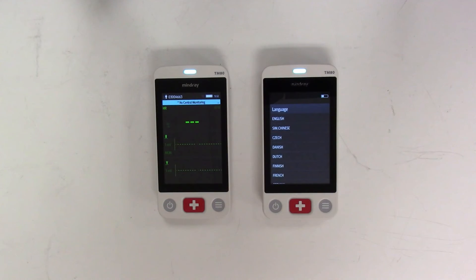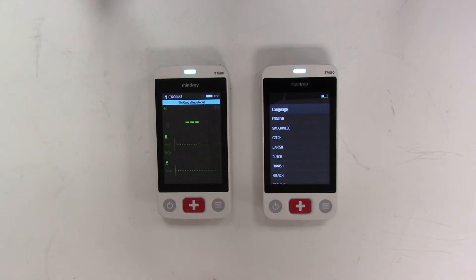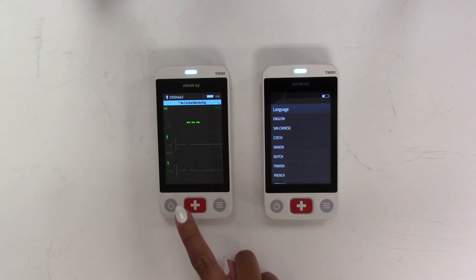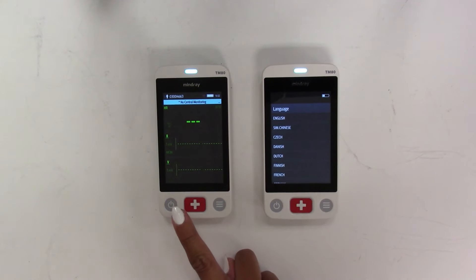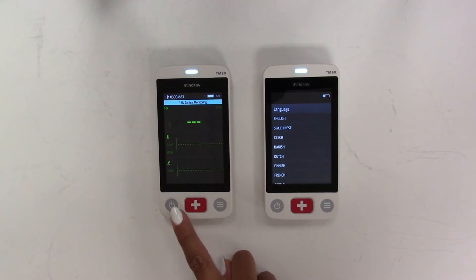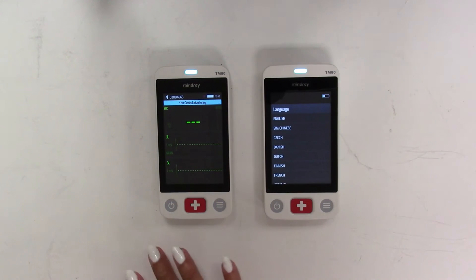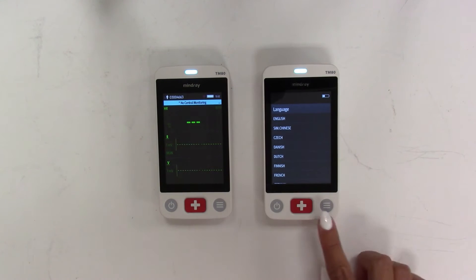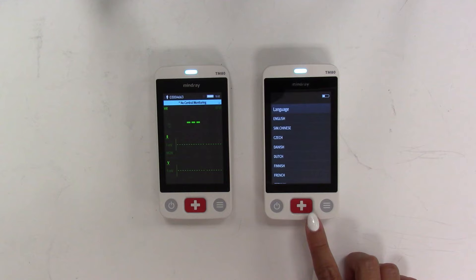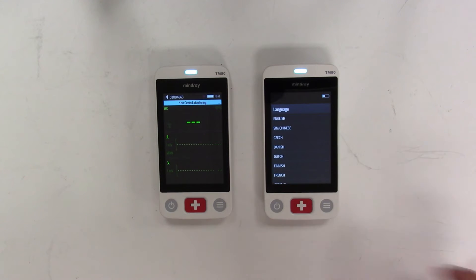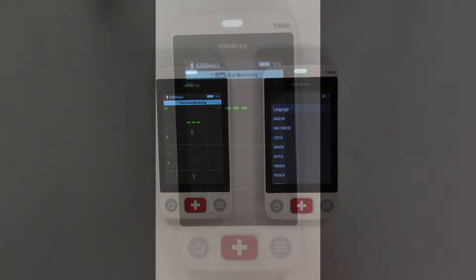The cloning procedure will require two telemetry transmitters. On the left is a hospital-configured TM80 that is currently running. We'll call this TM80A. On the right is a factory default replacement TM80 provided by Mindray. We'll call this TM80B.